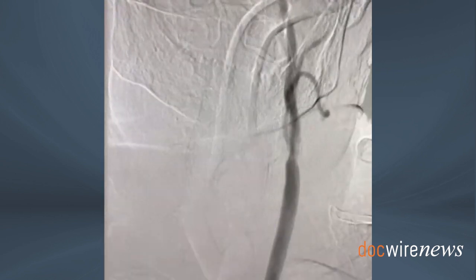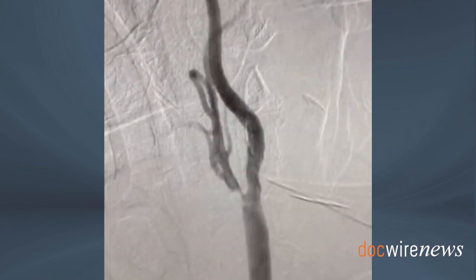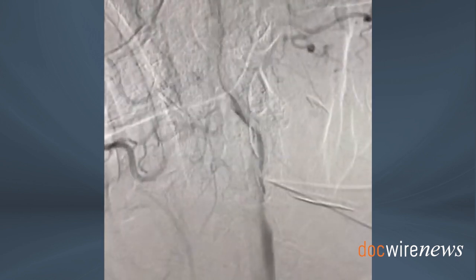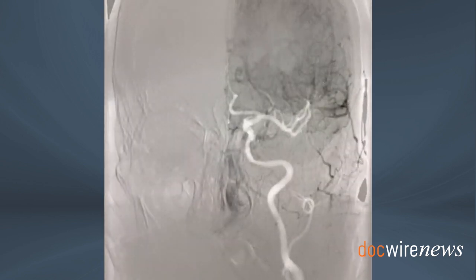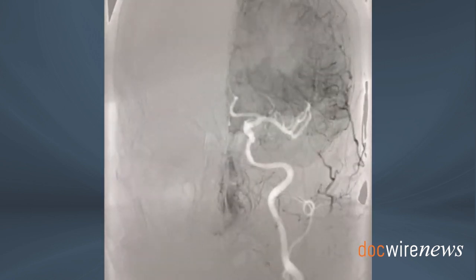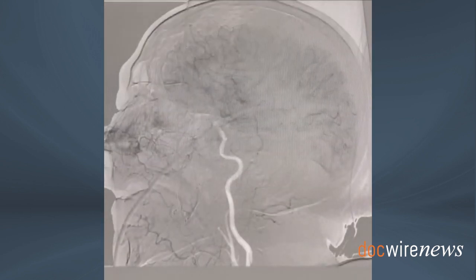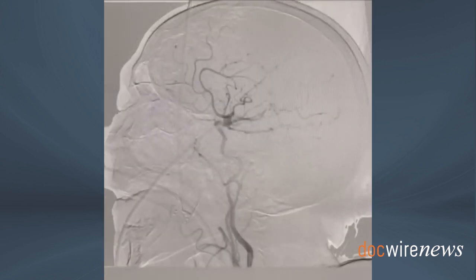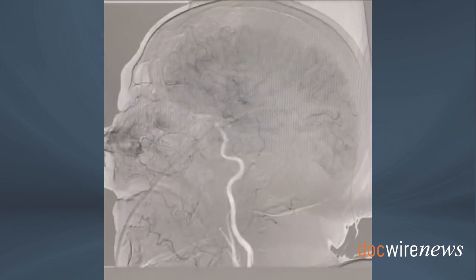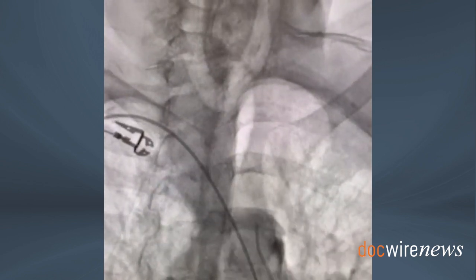An anterior-posterior projection of the left common carotid angiography is performed, then the left anterior oblique projection, showing evidence of a severe ostial left external carotid artery stenosis. Then the intracranial angiogram component — very important — showing middle cerebral and anterior cerebral artery without crossover, as well as lateral projection of the intracerebral carotid angiogram. Notice the diffusely decreased distal flow consistent with small vessel disease.